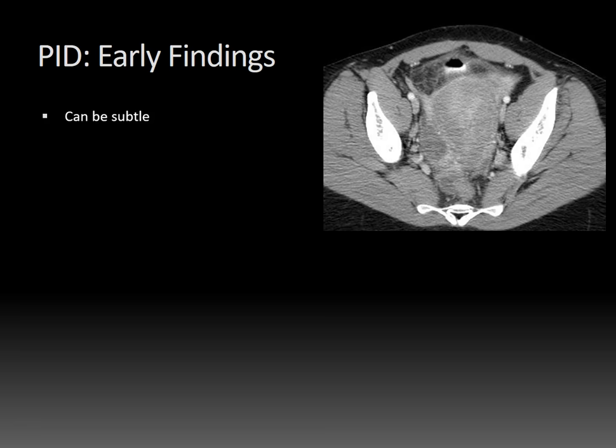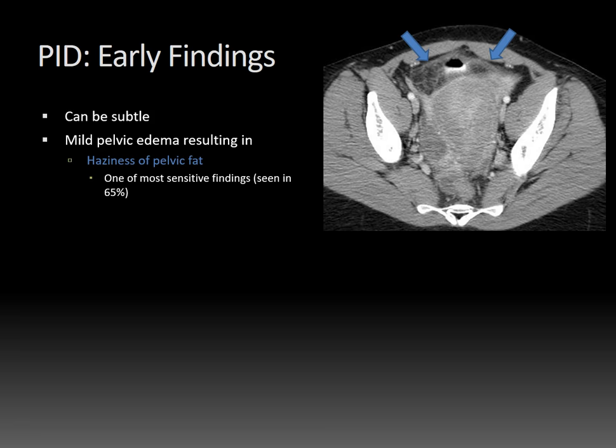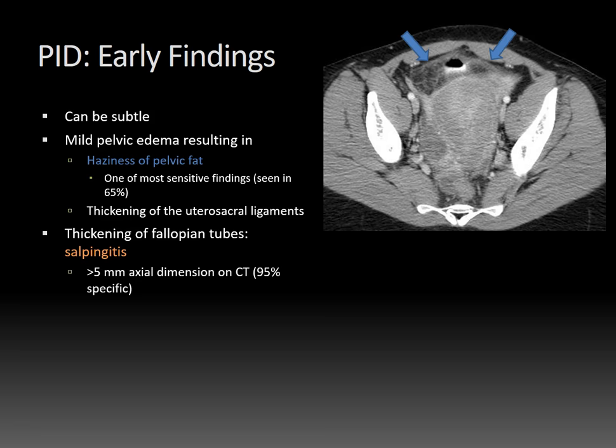Let's talk about the early findings of PID — they can be subtle. You might see mild pelvic edema resulting in haziness of the pelvic fat, as you can see here. This is actually one of the most sensitive findings, seen in 65% of patients. You can also see thickening of the uterosacral ligaments. The fallopian tubes themselves can become thickened in the setting of salpingitis, and studies have shown that greater than 5 mm in axial dimension on CT is actually 95% specific for salpingitis.